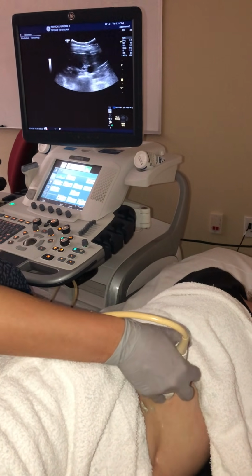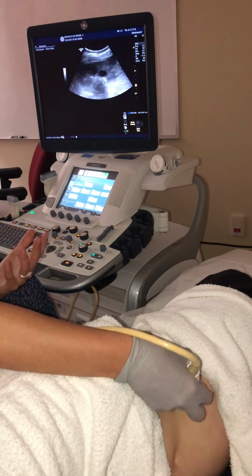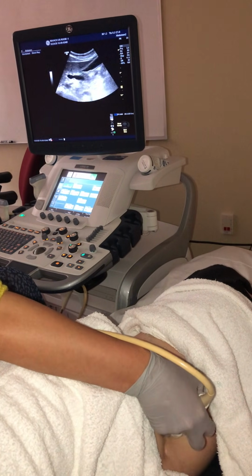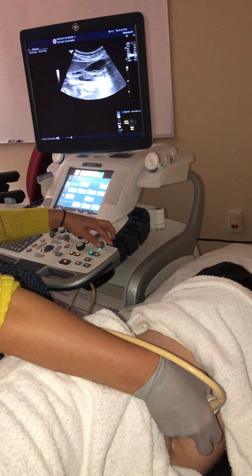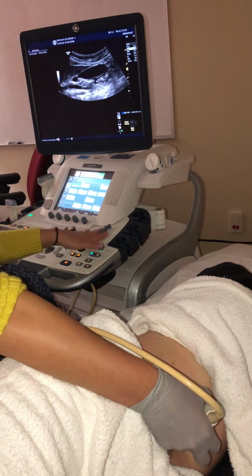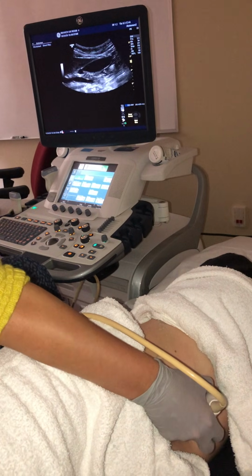And you just wanna adjust how you're scanning at this point because as we know, all of the anatomy inside is gonna rotate a little bit. So you just wanna go ahead and take a second to find it and see how it lays in this new position. So here we have our sagittal gallbladder in a decube position. Same thing, we want to make sure that we're nice and anechoic. And then just hold your breath.